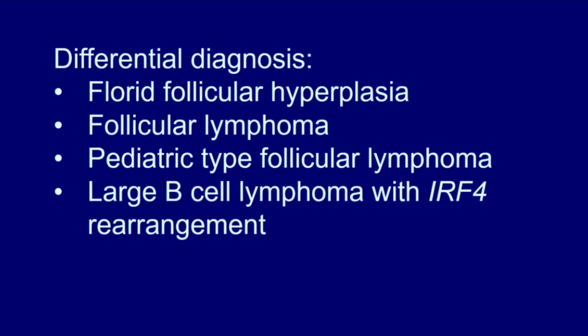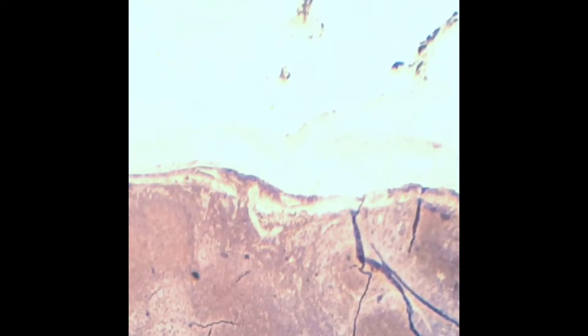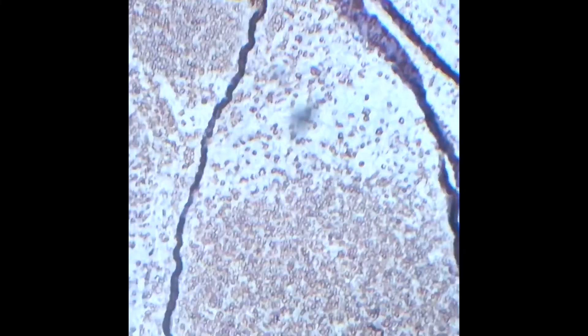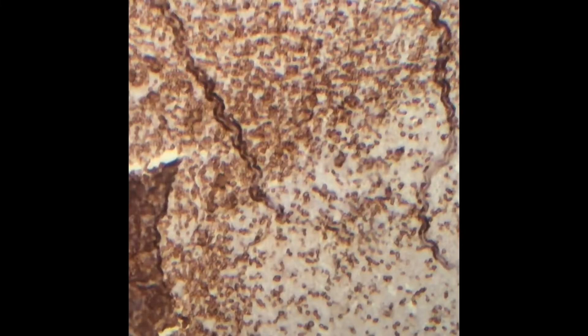Now we're going to look at immunohistochemistry stains. CD20 shows diffuse positivity within the nodules, within the atypical follicles, and you can see that the paracortex has some scattered B cells in it as well. CD3 has a little bit of background, but it is negative in the follicles.